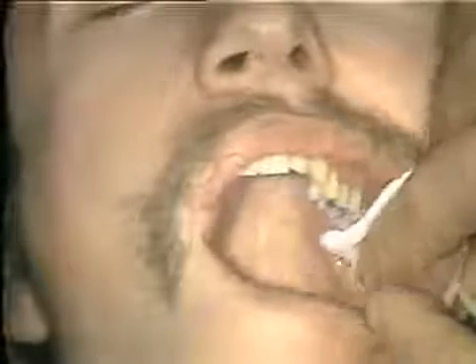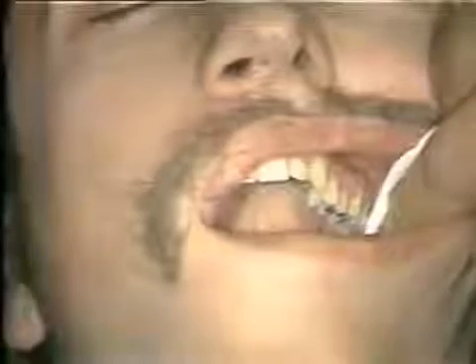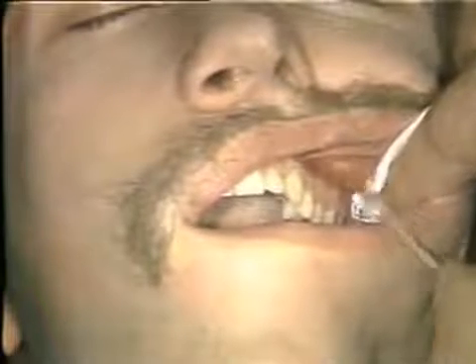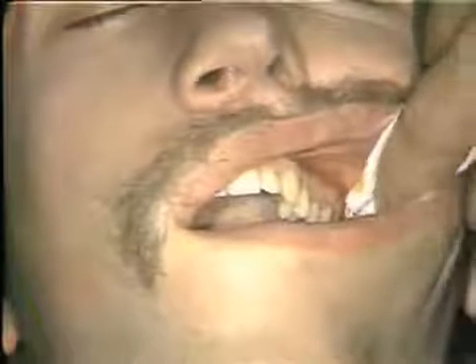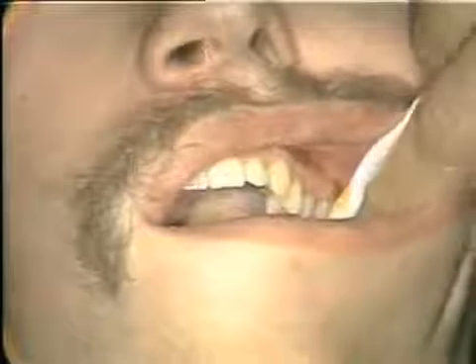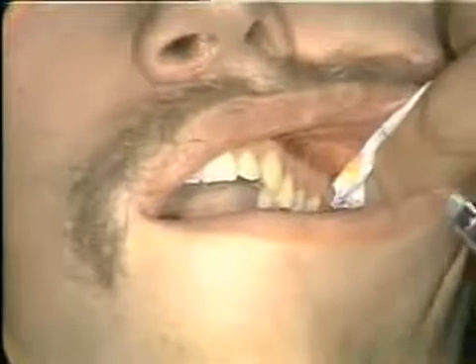And if you'll open about halfway for me, please. And we might close just a little bit. That's perfect, Andy. I'm drying the mucosa here now. And then we'll apply our tincture of betadine directly above the first molar. Now you'll notice that again, with the cheek retracted, how tense the vestibular tissues are.